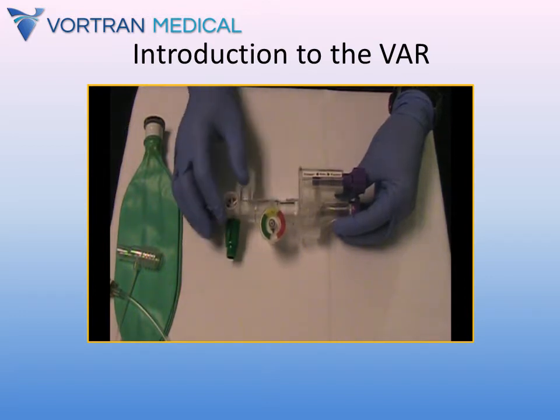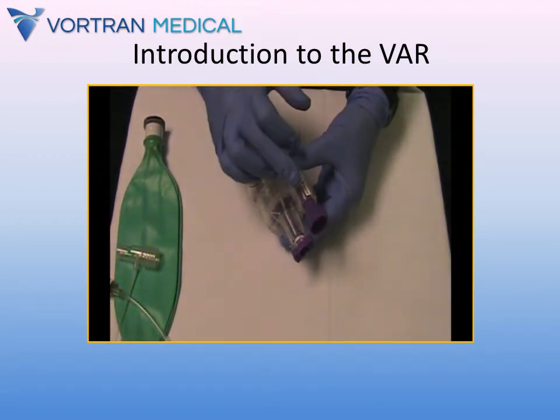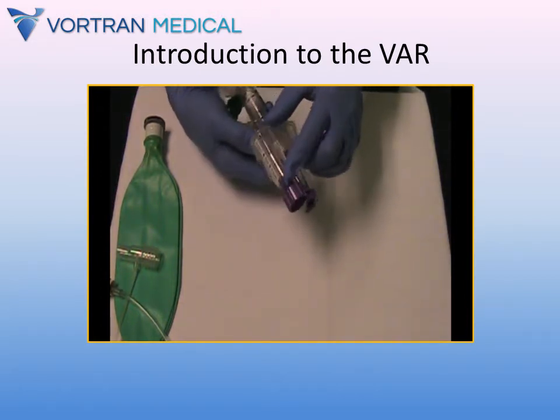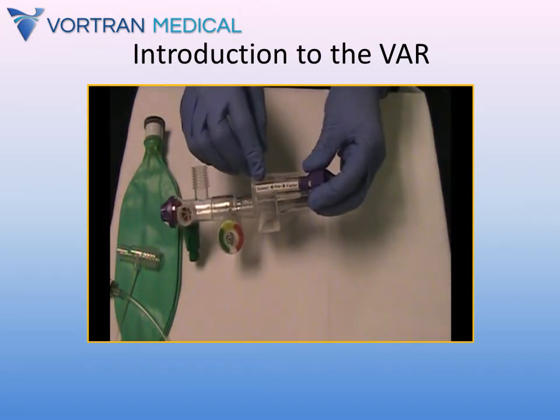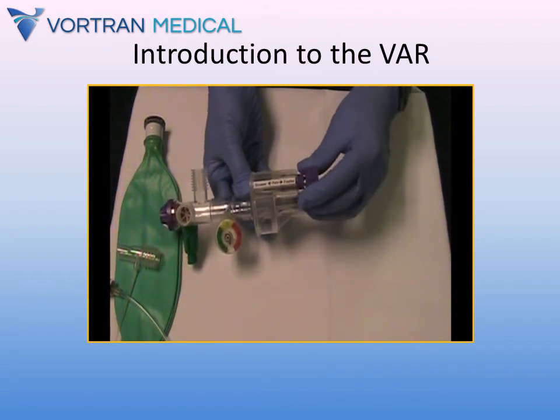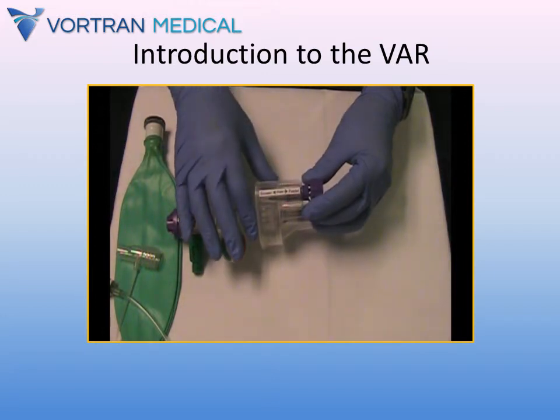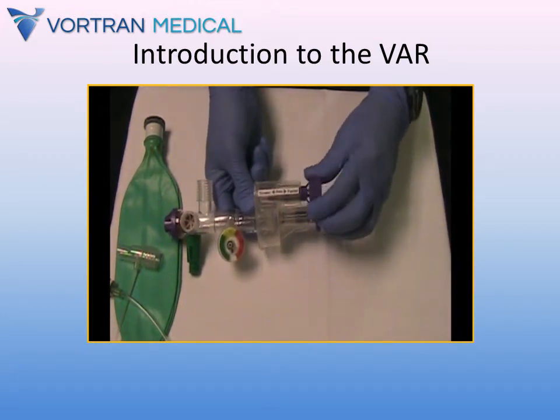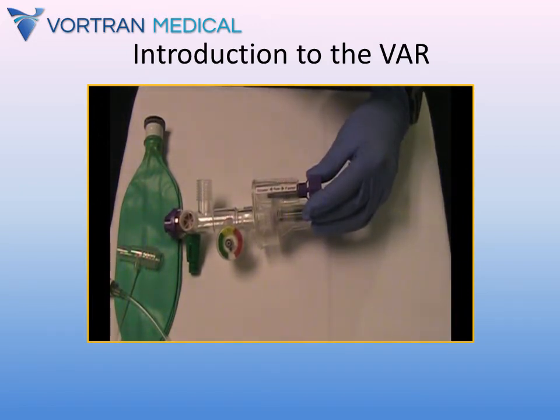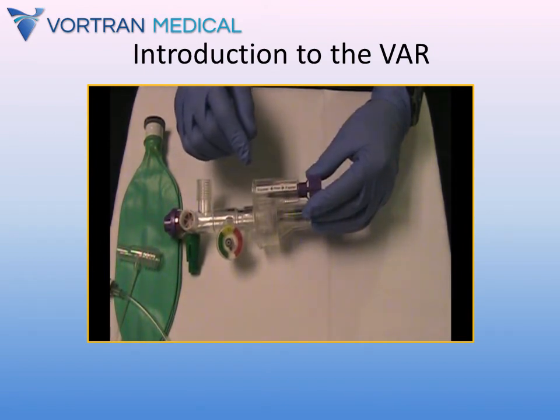Lastly is the patient modulator here. This is going to set your tidal volume and your respiratory rate. Now this is the round respiratory rate knob, and you can see right here it reads slower and faster. The more I screw this knob in, the slower I will be able to expire air, and the slower I'm going to drop the pressures in the airway. And the more I screw this valve out, the faster I will be able to expire air, and the faster I will drop the pressures in the airway. And that's an important concept, and we'll go into that in a few minutes.